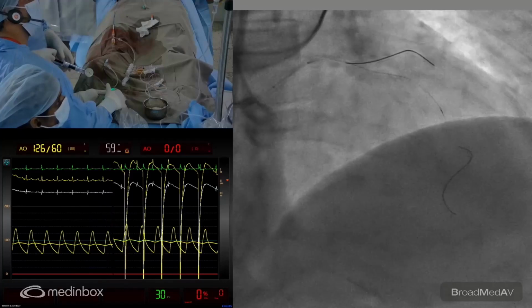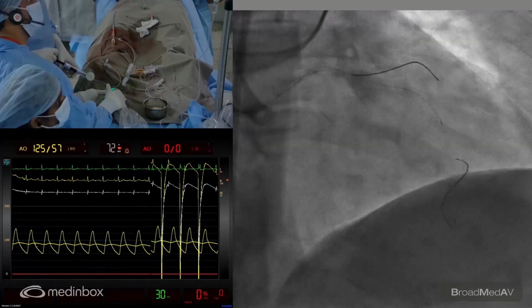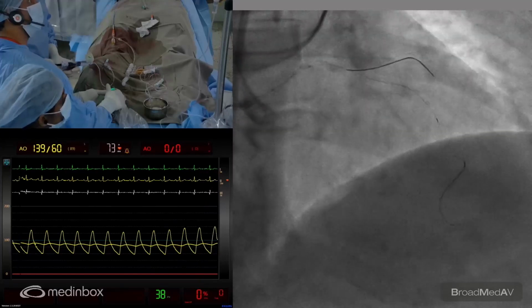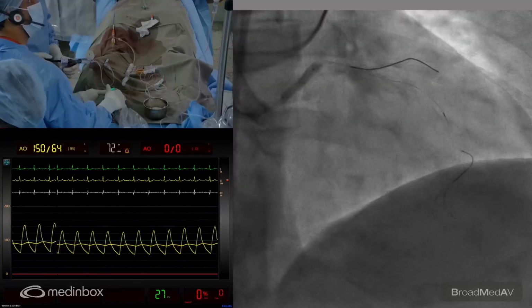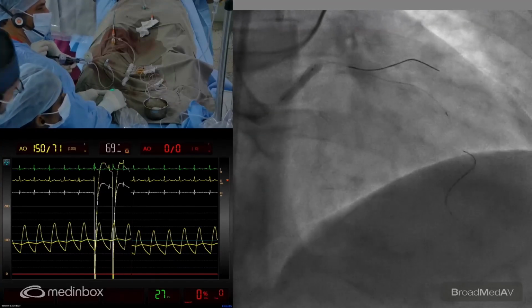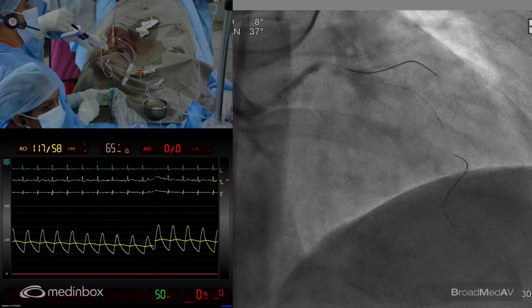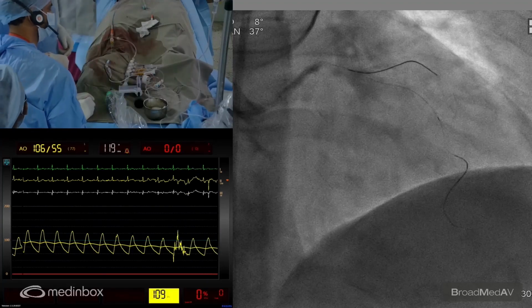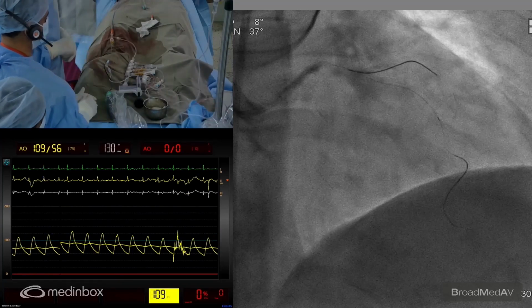And we saw the pressure fall. So we have deflated it. Now I'm going to inflate it again at 4. So we had 5 pulses, and now we go up again. Deflate, sir. Okay, so this was done. The first round is over. So let's see how it happens.